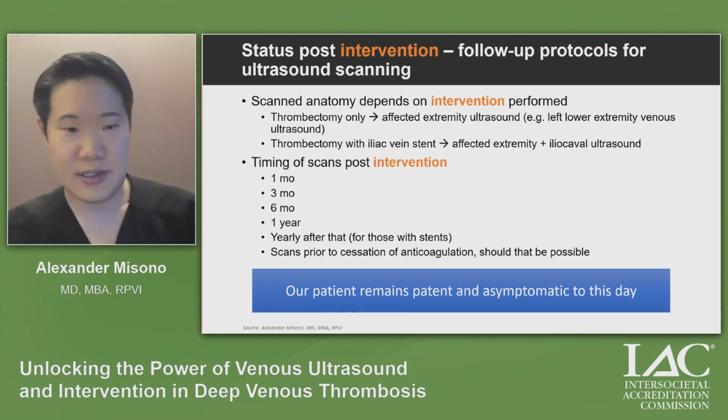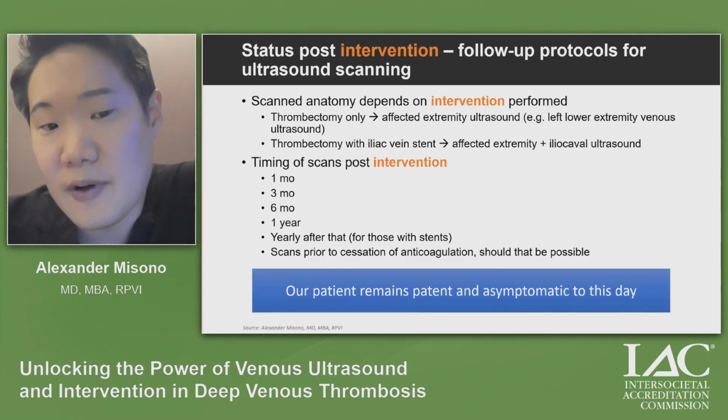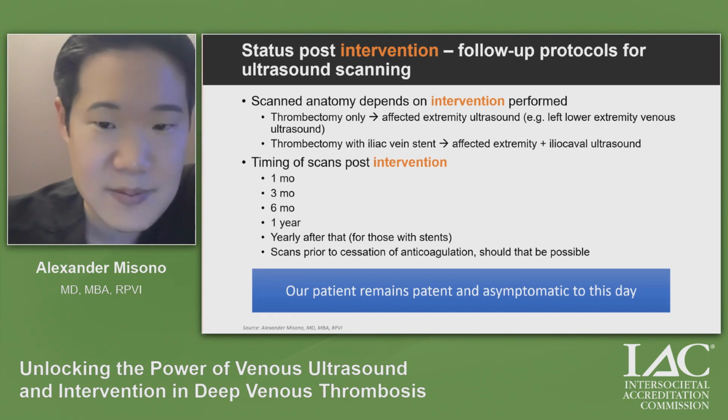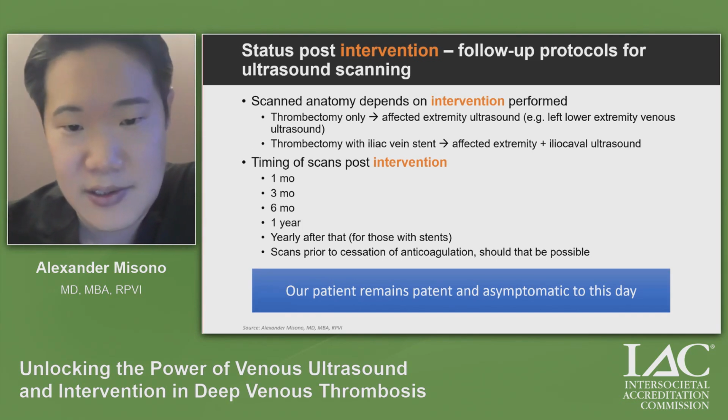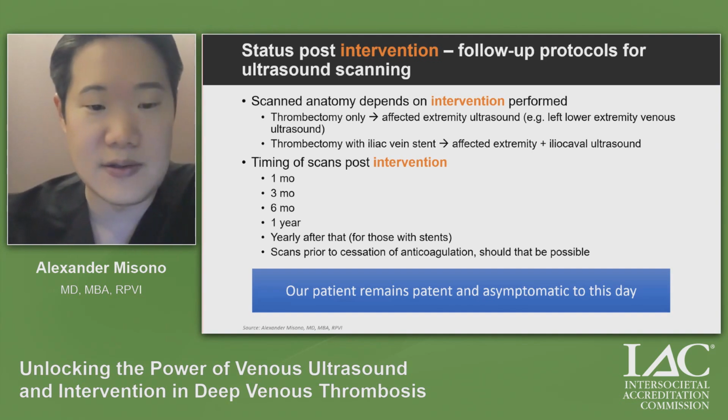You might be wondering, well, you did a great intervention. What do you do in follow-up? So I do scan these patients in follow-up. The anatomy that I scan depends a bit on the intervention that I did. It's very customized as to what I did. Is it thrombectomy? Is there a stent? Where is the stent? And so forth.